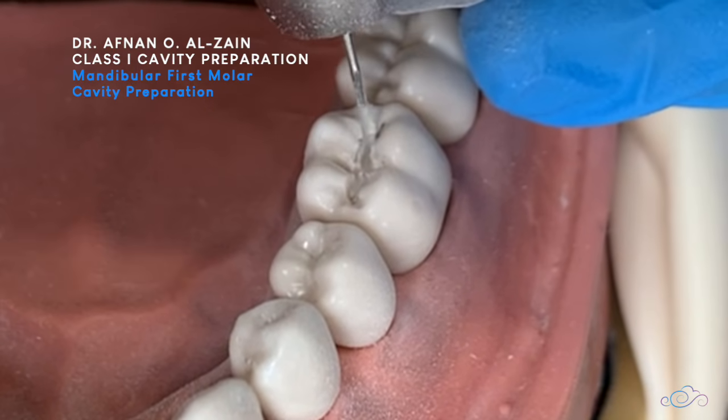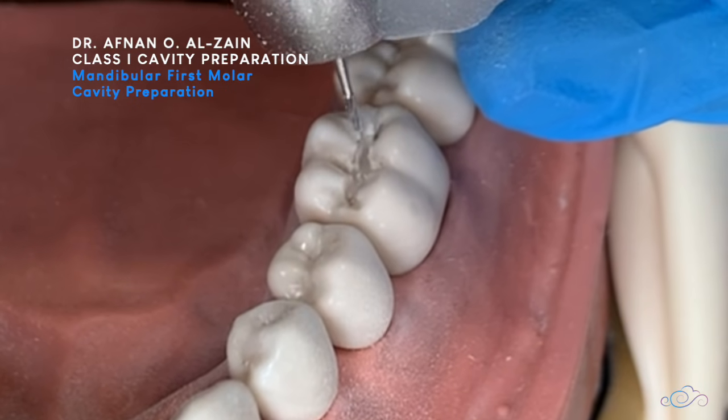After this, we won't miss the distal groove.